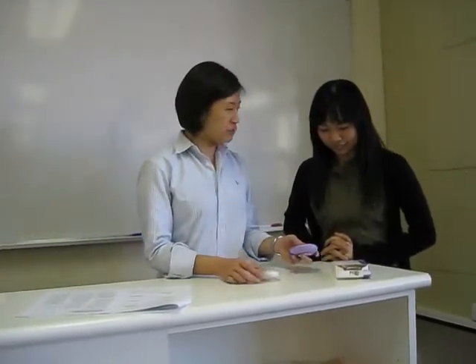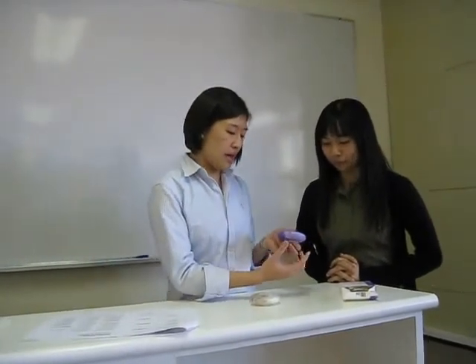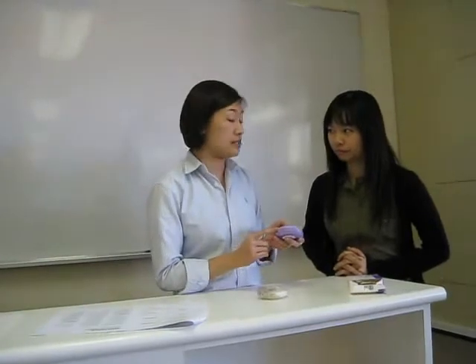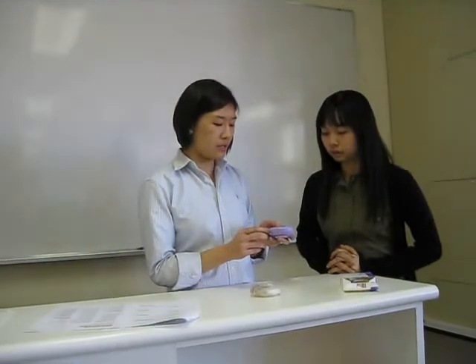Oh, it's a cute one. Yeah, it's pretty nice. As you can see, this is the outer pocket of it. And this area is the foam grip where you can put your hand and help you to use it. Can you see there's a number sign here? Yep. This is an indicator of telling you how many doses are left. You see 60 here — that means the dose count is 60. Every time after you use it, it will decrease by one. When it comes to about five times left, it will turn red, from five to zero, telling you it's time to get a new one soon.